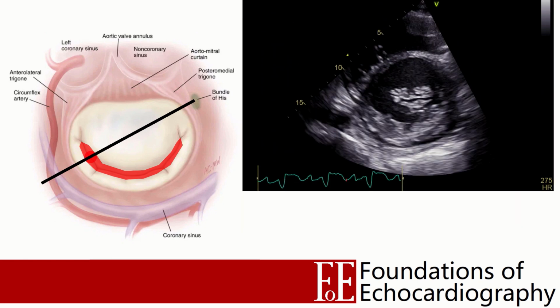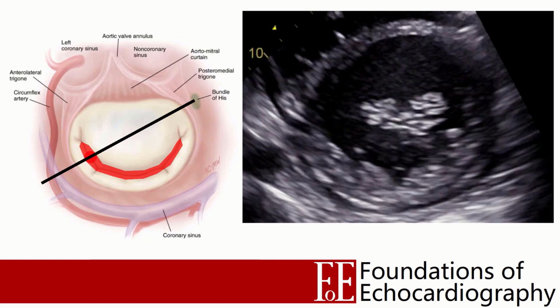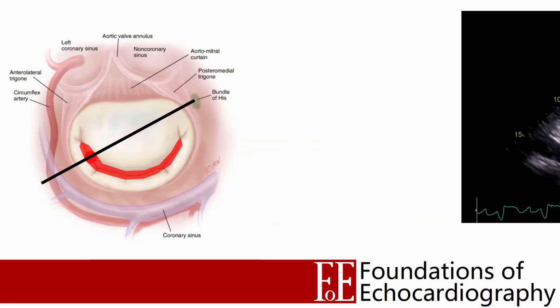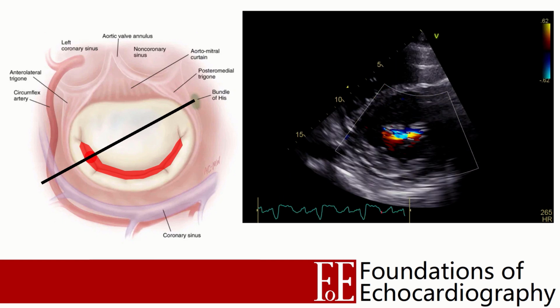If we look at the mitral valve from a parasternal short axis view, we can see that a large part of the etiology of this MR is annular dilatation, pulling the leaflet edges apart, such that they fail to meet along the entire length of the coaptation line. Placing a colour box over the mitral valve here gives a much better indication of the size and shape of a true regurgitant orifice.